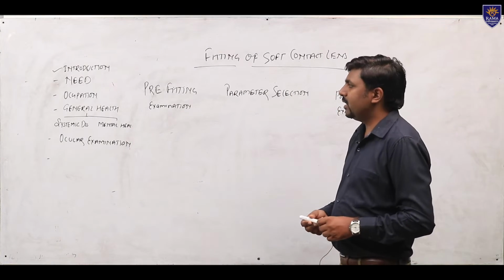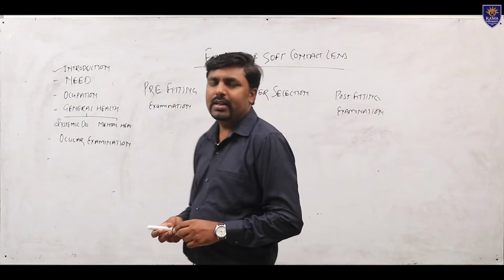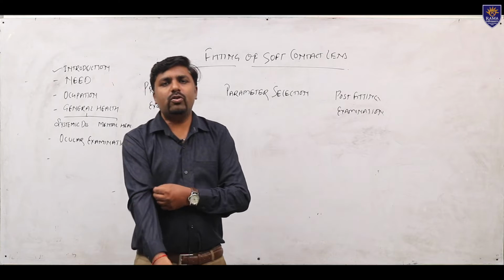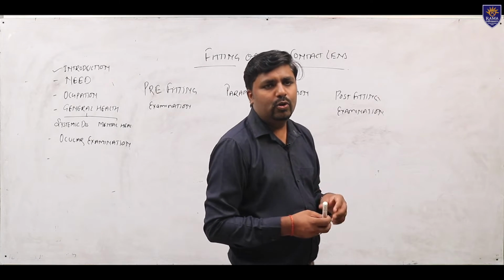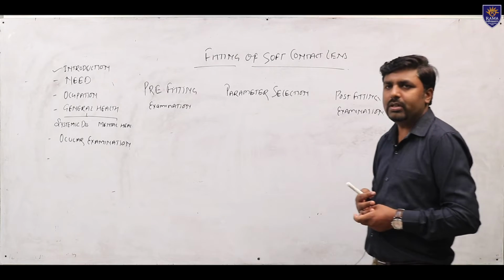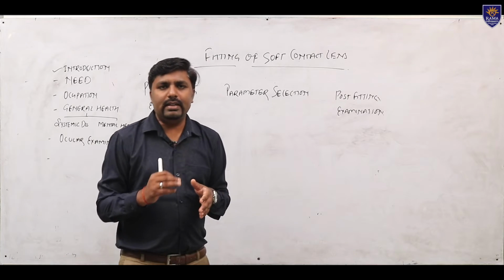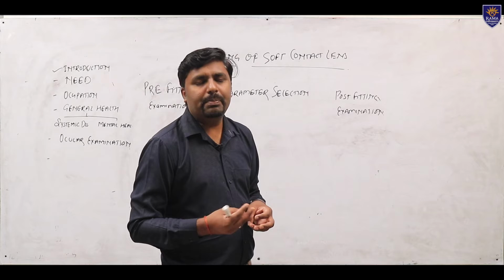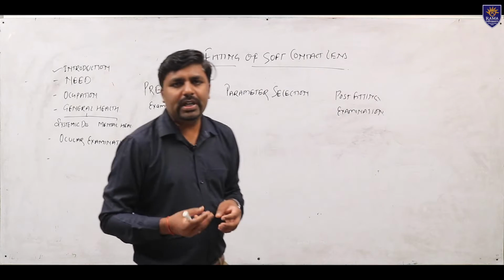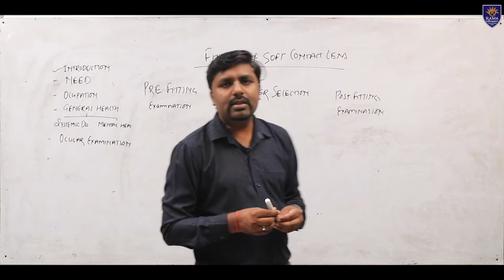First, we discuss what fitting is. Fitting of contact lenses is the most important part to dispense the contact lenses. As we fit the contact lenses, we require a pre-fitting examination. In pre-fitting examination, we should know the need of the patient: why the patient needs contact lenses, for refractive purpose, therapeutic purpose or cosmetic purpose. So, we should know why it is required.